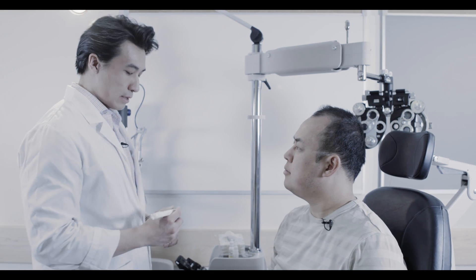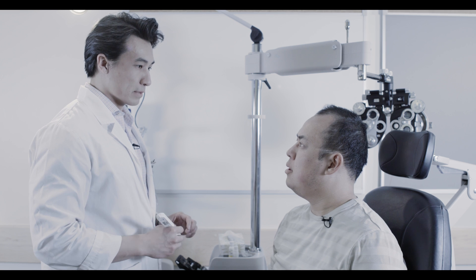I'm going to test the pressure of your eyes now. As I'm doing this you might feel some light pressure, but no pain, and just try to look ahead while I'm doing this.